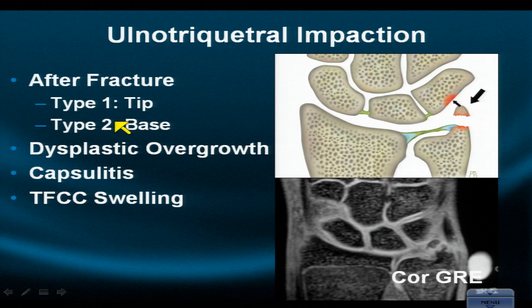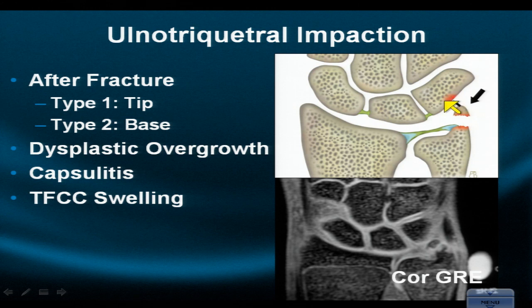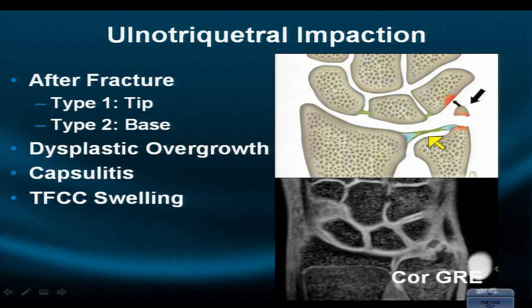If the ulna lies distal to the radius, patients are prone to ulna-lunate abutment syndrome and degenerative triangular fibrocartilage tears. Here is an example of ulno-triquetral impaction, which can occur as a result of a fracture at the tip or base of the ulnar styloid. When the patient is in ulnar deviation, these two structures may crush or crunch together. Be careful — this area of the triquetrum is normally undulated, and you should look for inflammation, cystic change, or an etched marginated erosion.